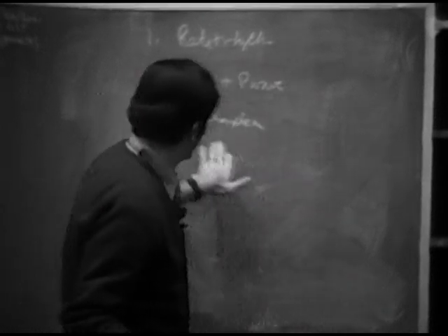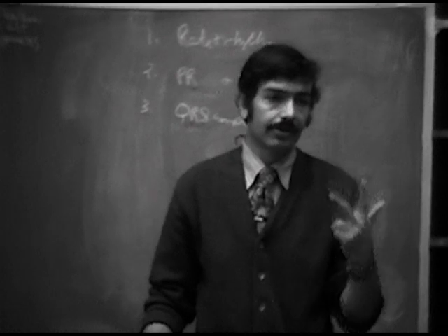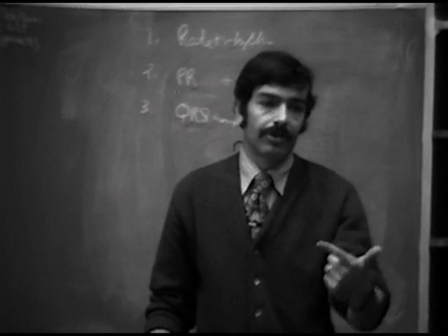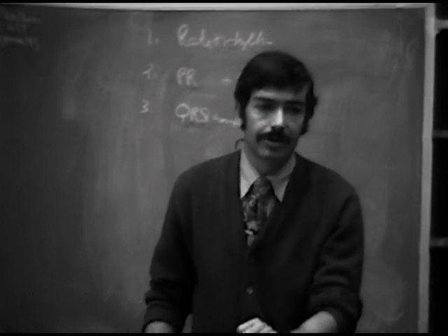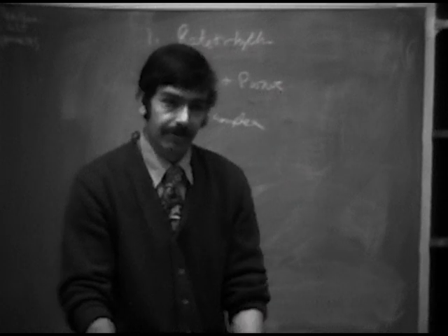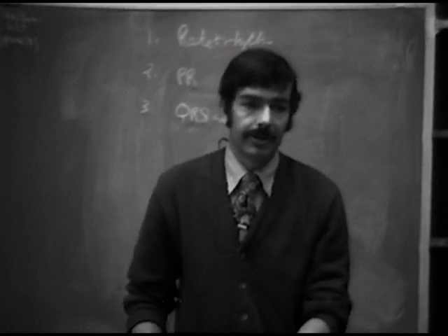Okay, so then you look at your electrocardiogram and you say to yourself, which part of that QRS is prolonged? Is it the beginning? Is it the whole thing? Or is it the end? If it's the beginning, you're dealing with a WPW, most likely. If it's the whole thing, you're dealing with intraventricular block. If the terminal portion of the QRS is prolonged, you're probably dealing with a bundle branch block, though you may be dealing with a peri-infarction block. That's less common. By far the most common form of terminal conduction disturbance, though, is a bundle branch block.